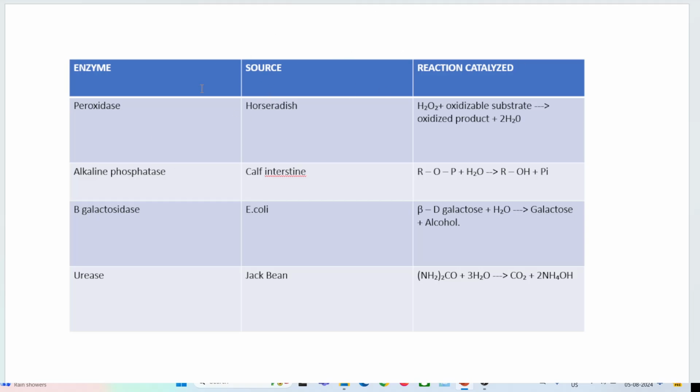Now, the peroxidase enzyme reaction is a redox reaction. So we will give the peroxide. In the redox reaction, at the end of the day, you get the product, and that product is again made to react with the chromogen. The chromogen is added to it, and that gives the color. That color is directly proportional to the antigen present. So let's say a person has a very dilute amount of antigen, the color will be dilute. If the antigen is higher, the color will be more intense. The dilutions are done in the microtiter plates as well.